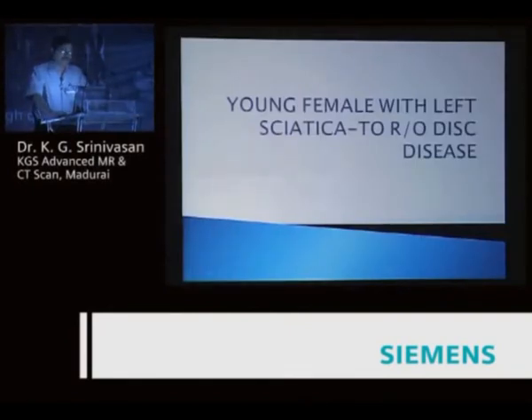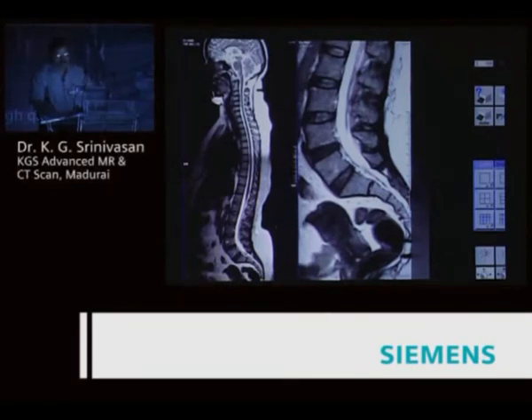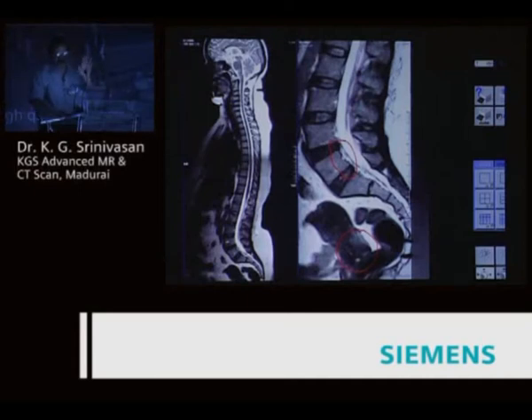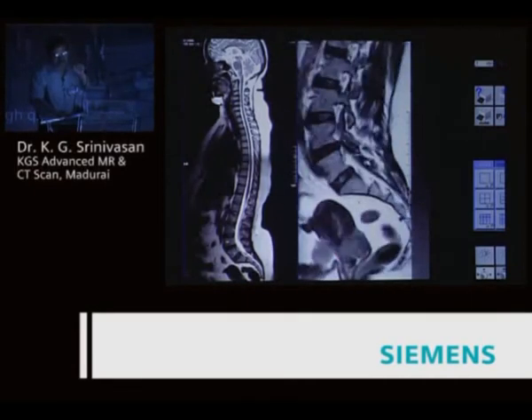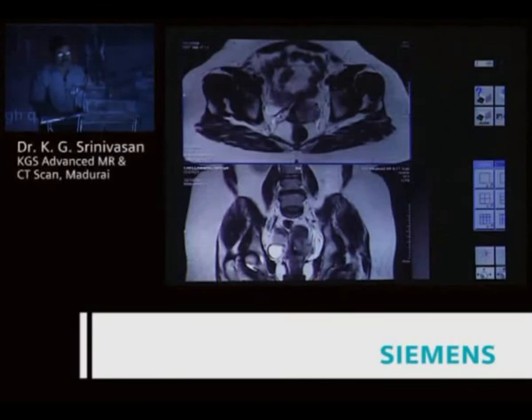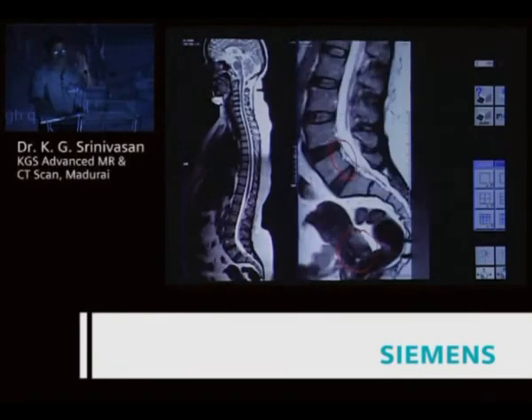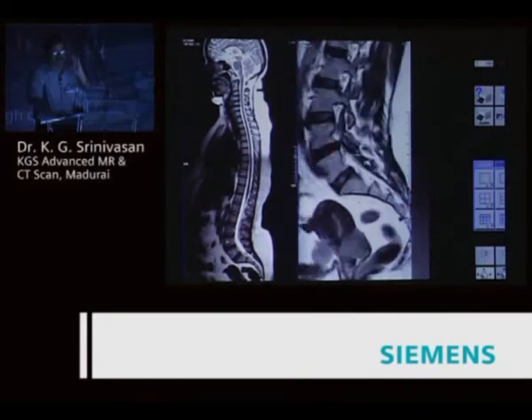Young female with left sciatica to rule out disc disease. Whenever doing whole spine, you should also evaluate the pre-sacral region. The disc and parasagittal foraminal sections look normal — but carefully look at the cervix. You can see the cervix is showing a mass extending into the parasagittal region, with parametrial infiltrations responsible for the sciatica.